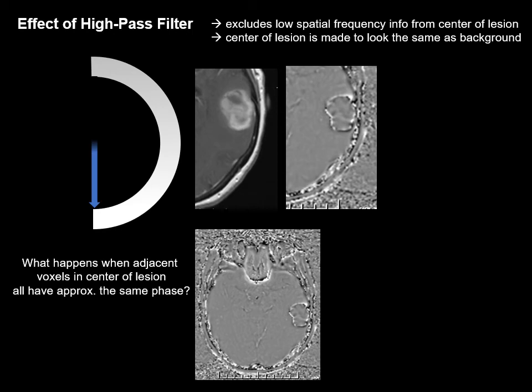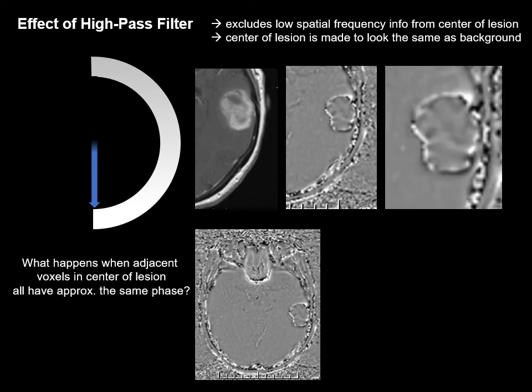So we're going to magnify that up. If we look at the image as we move from outside the lesion to the edge, we get a positive phase change due to the presence of blood, and so it shows up as white on the phase image. I'm going to magnify it further. So I would conclude in this particular instance, although I have no proof of this, that we have a phase change at the edges of the lesion to near the maximum allowed by the grayscale, but the phase change probably plateaus in the middle of this lesion. It does not increase any further.